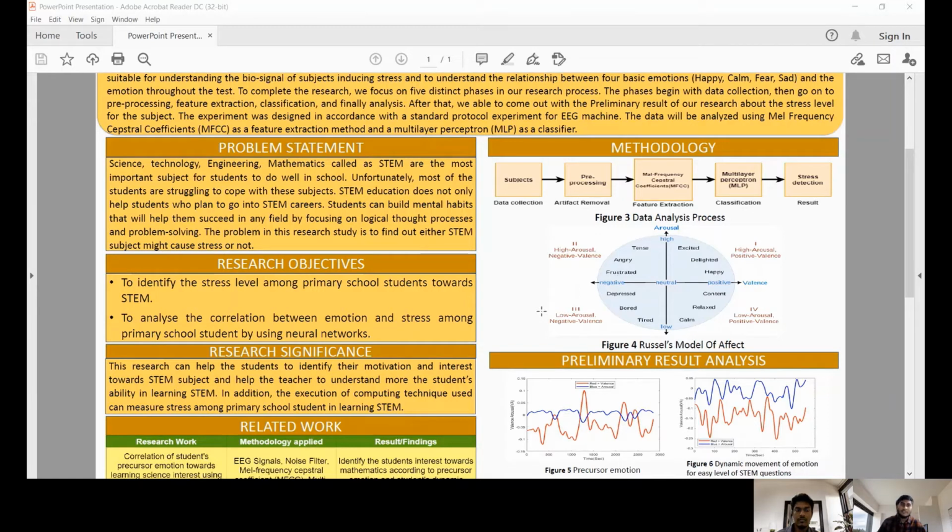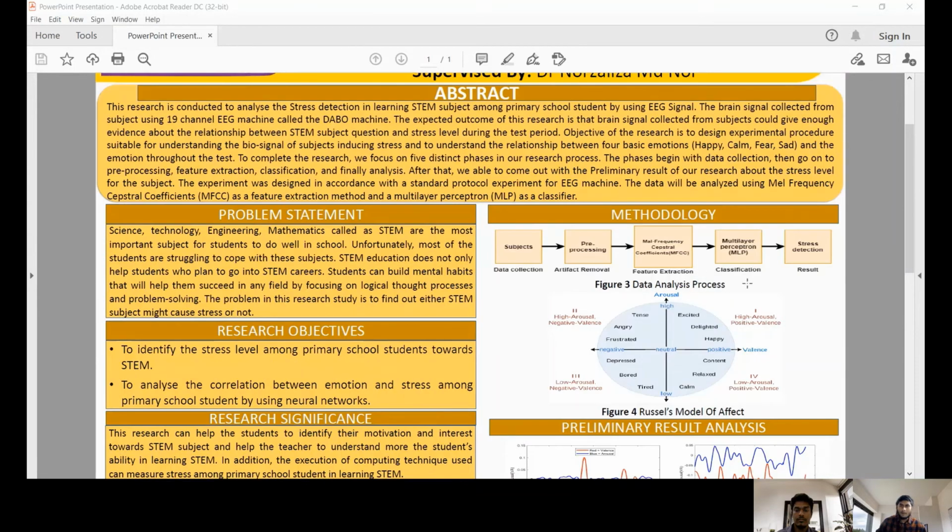Feature extraction is used to simplify the dataset to shorten the process of classification. And important features are extracted by using MFCC for giving high reliability and accuracy for the training dataset. Training is required by matching up the value of valence and arousal with the respective type of emotion by Russell's model of affect. The result of the test is classified by observing the plotted valence arousal graph.